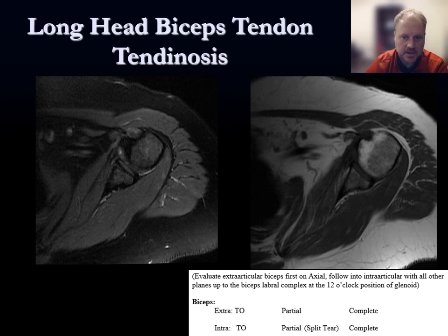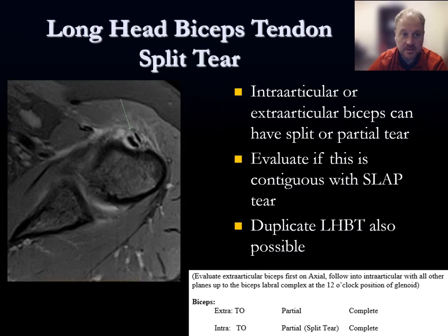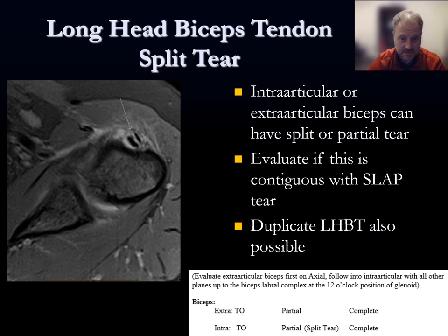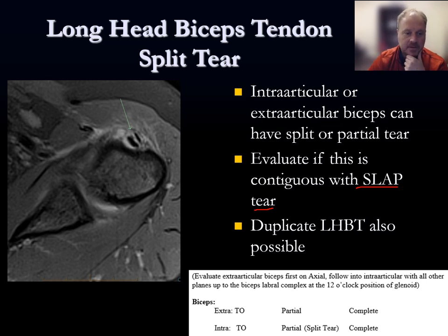Long head biceps tendinosis follows the same rules as other tendons: thickened tendon with T2/PD fat sat hyperintensity that is intermediate to increased in signal but not fluid-bright and not absent. Other pathology includes partial tears, split tears, and tears at the biceps labral complex that can be part of SLAP tears. An uncommon but described finding is a duplicate long head biceps tendon.